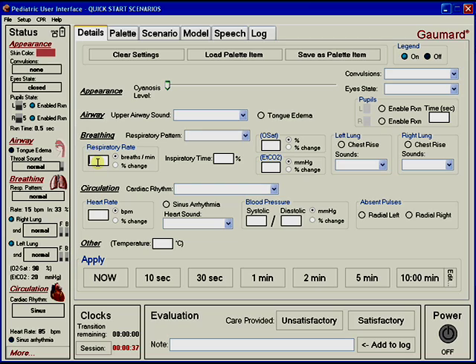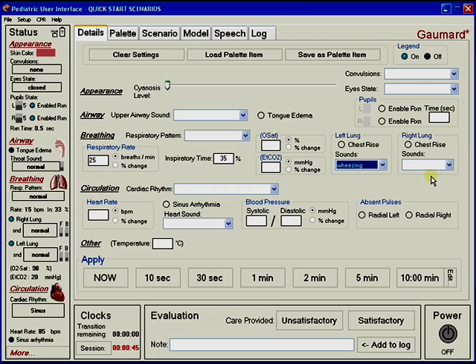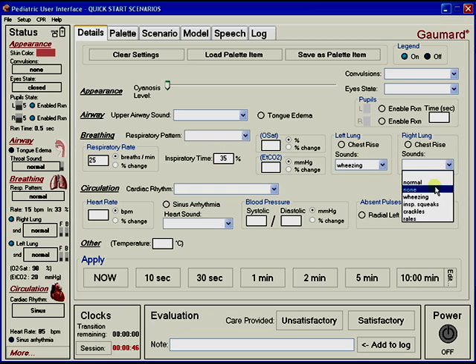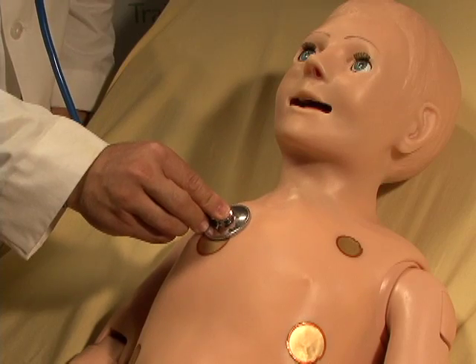Pediatric HAL has multiple upper airway sounds which are synchronized with selectable breathing patterns. Users can easily control rate and depth of respiration and choose independent left and right lung sounds. Multiple sounds are available.